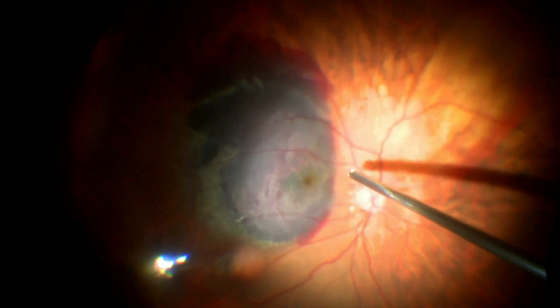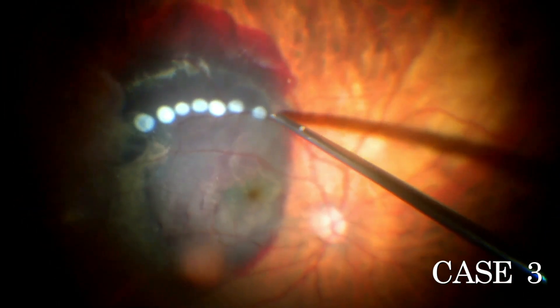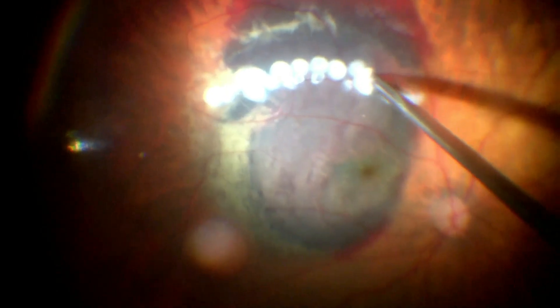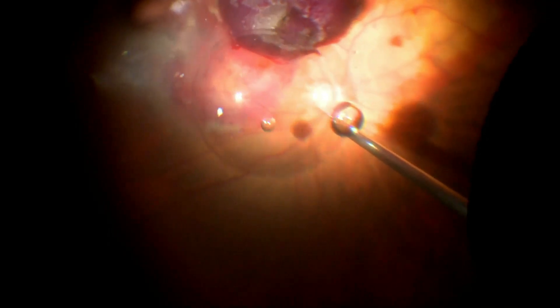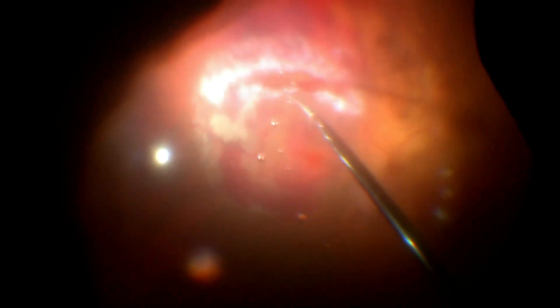In this case, the smiley incision is planned inferiorly due to the eccentric location of the hemorrhage. The subretinal complex is then engaged and extracted with the cutter. PFCL is injected, following which the complex is cleared. Endolaser is done under PFCL, followed by fluid-air exchange and gas tamponade.